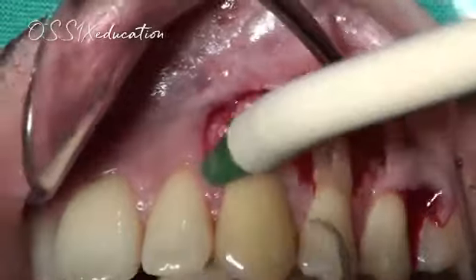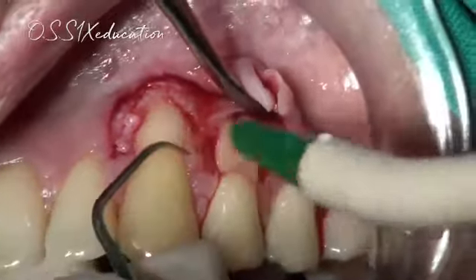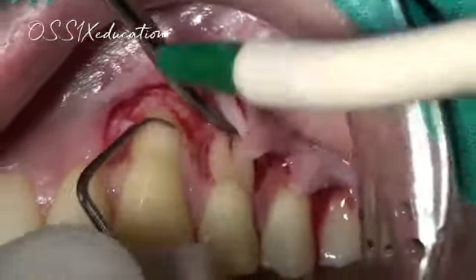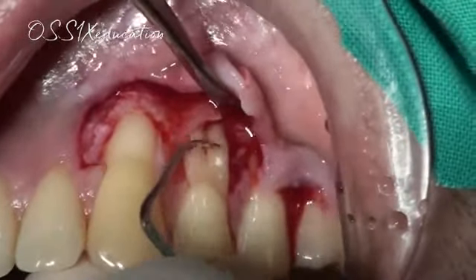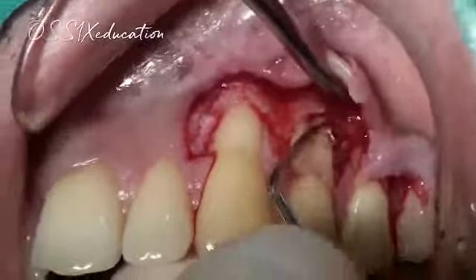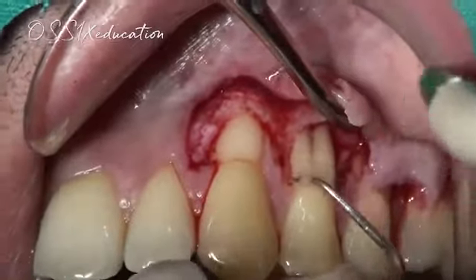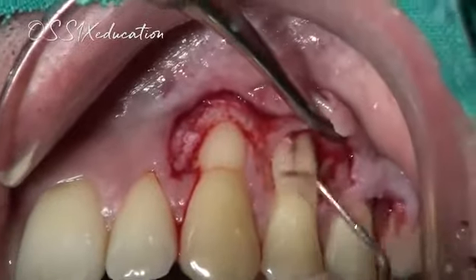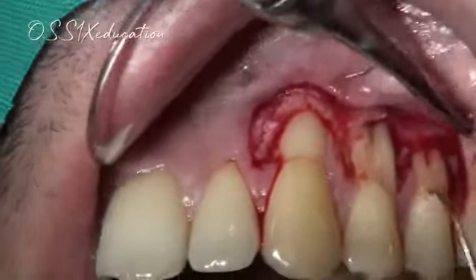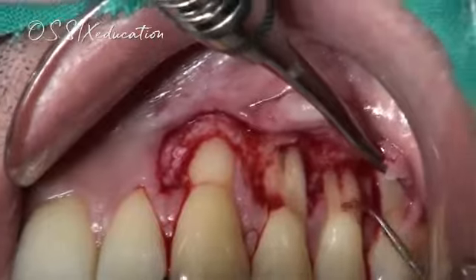As in every perio procedure, we will prepare the root surface and scale everything. Now this is my favorite curette for the buccal and palatal sides. It's always the sharpest. You have to scale really nicely, but not aggressively, but you have to really make the surface disease free. All of the exposed cementum that has been there for a very long time has to be smoothened out, so we remove this.